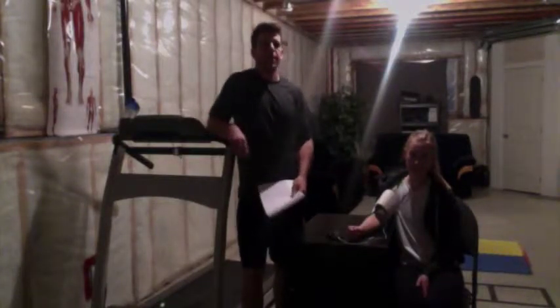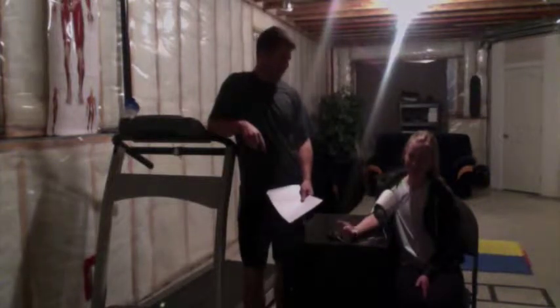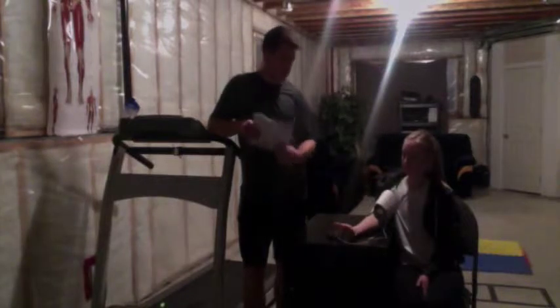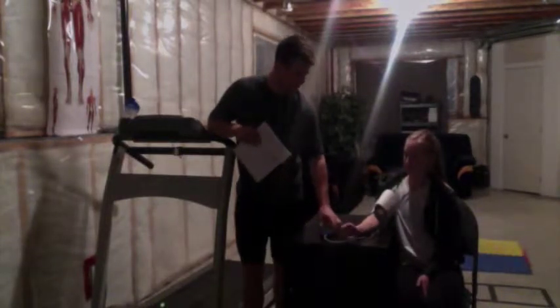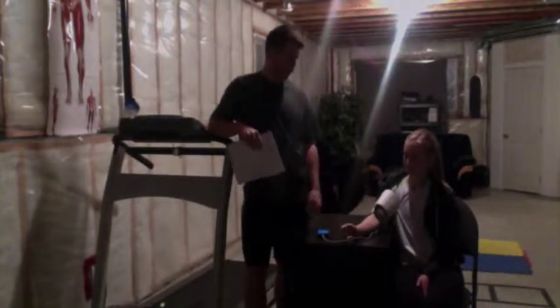Hi, I'm Scott Doucet, and for my course 1223 performance-related monitoring session, I've got Kaylee here. We're going to start things out with a blood pressure test, just to get a baseline, and then we're going to take it again after the test. And this is a nice, handy, computerized one, so I don't really have to do anything. Just let the app take care of it.